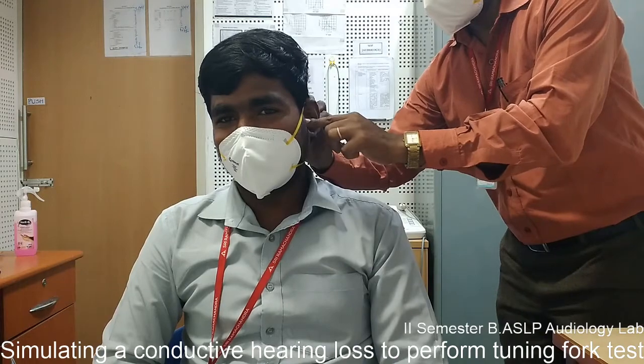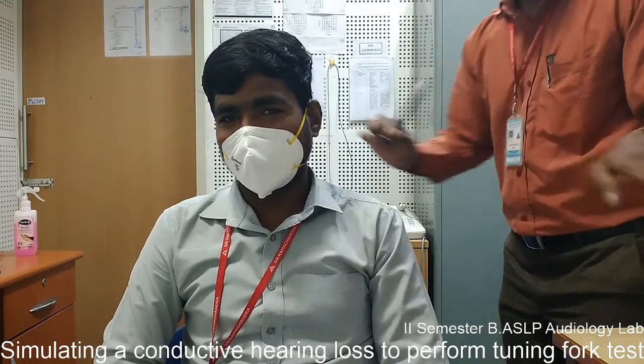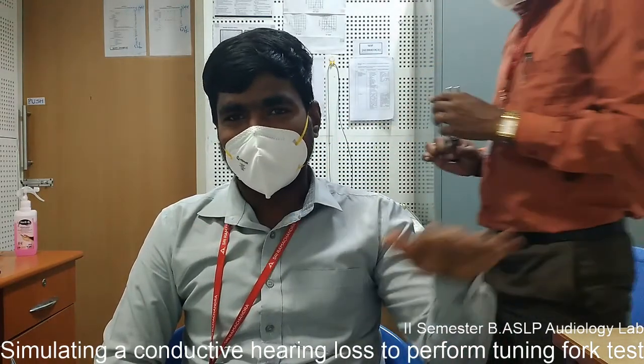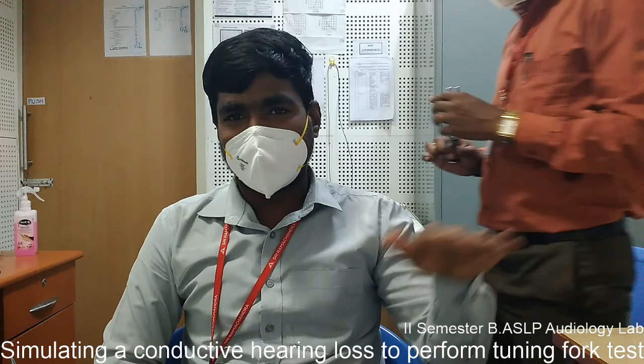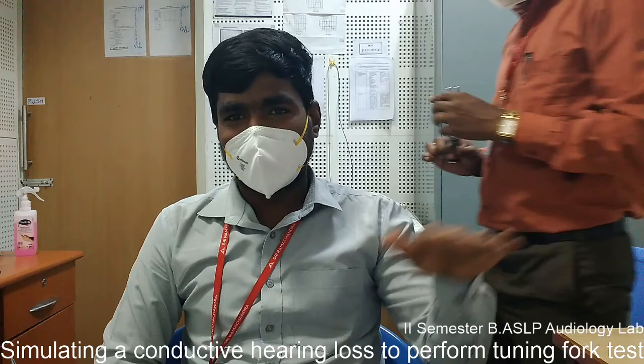Now the Bing test is performed. The ear canal was already occluded with cotton. Hence the additional occlusion created by occluding the ear canal did not cause any change in the loudness perception. The subject indicates that the loudness was constant — there was no fluctuation in loudness perception.